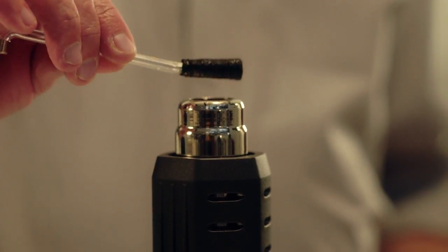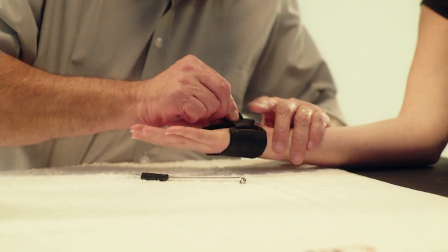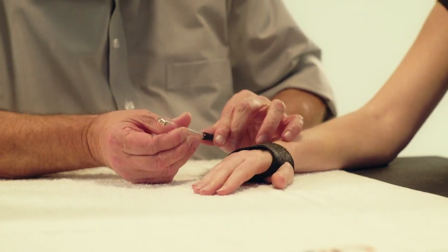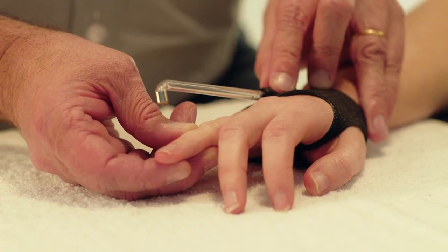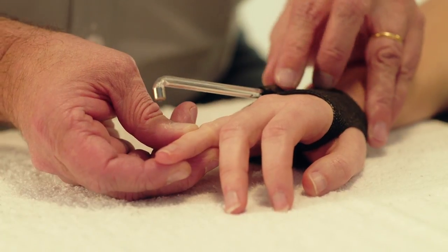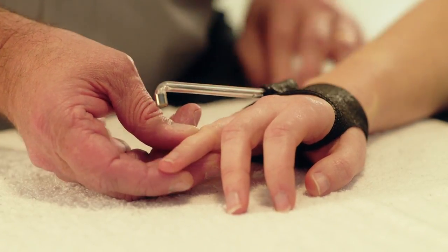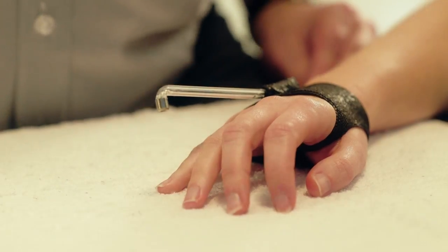Heat the OrphiCast with the heat gun and adhere the Orphi tube onto the orthosis. The Orphi tube is attached and aligned with the injured finger and the bent end is angled over the DIP joint crease.